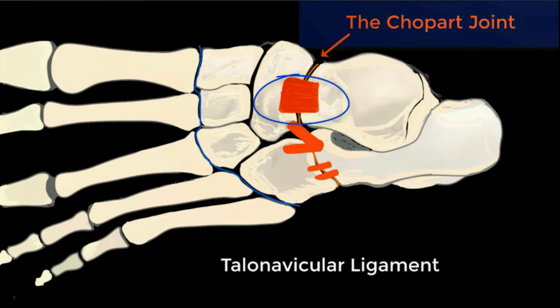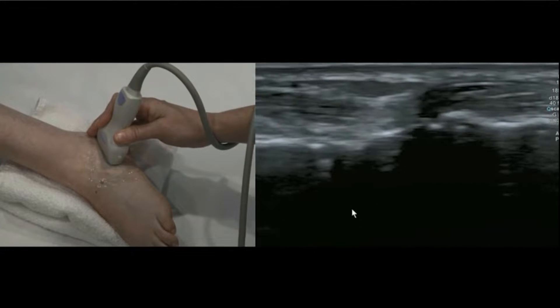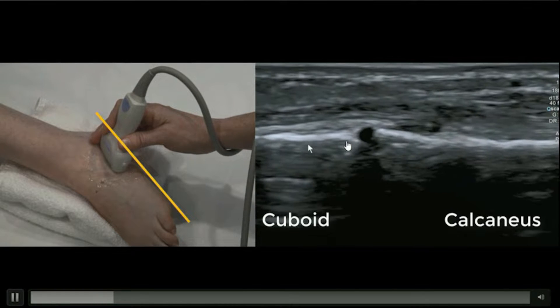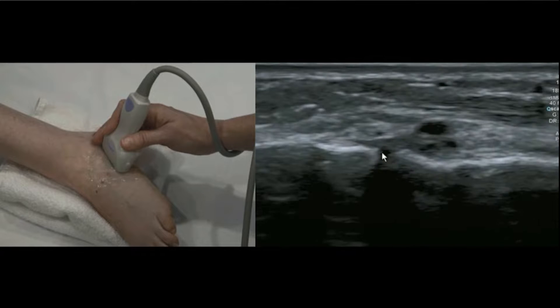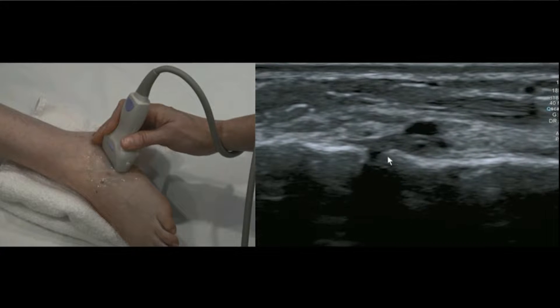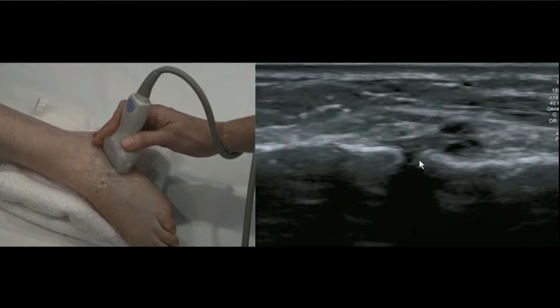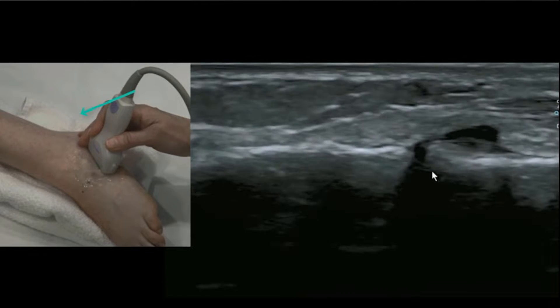Starting laterally, if you just place your probe on the lateral foot you'll see the calcaneus. Zoom forward until you identify the first joint, which is calcaneo-cuboid. Stay parallel with the sole of the foot, then moving up and down you might appreciate 1, 2, or no bands of this dorsal calcaneo-cuboid. In this case we can see it nicely because there's some joint fluid pushing out and helping to outline it.